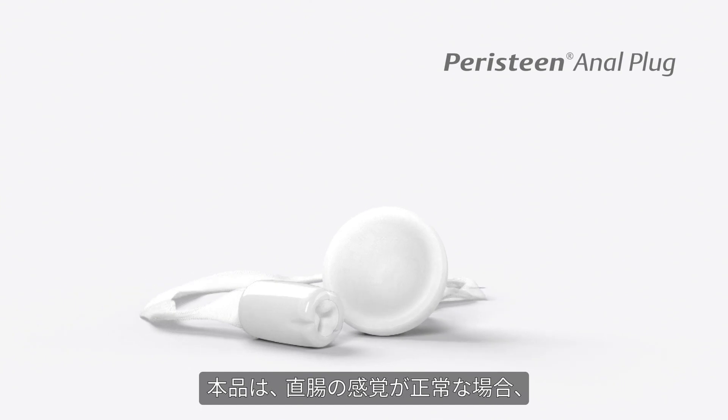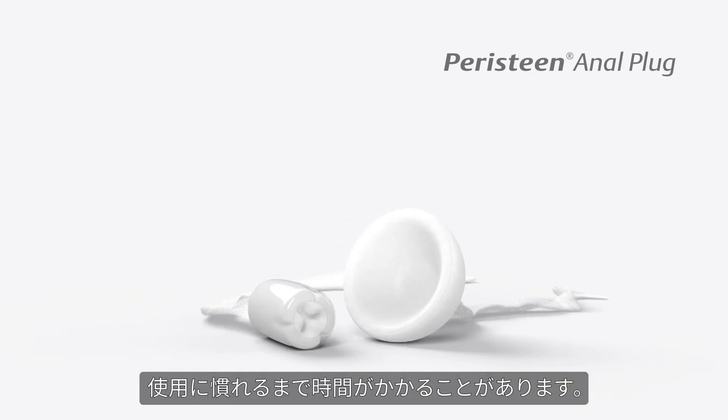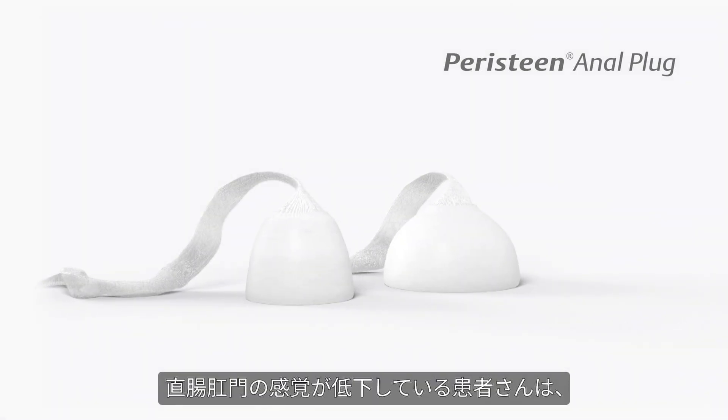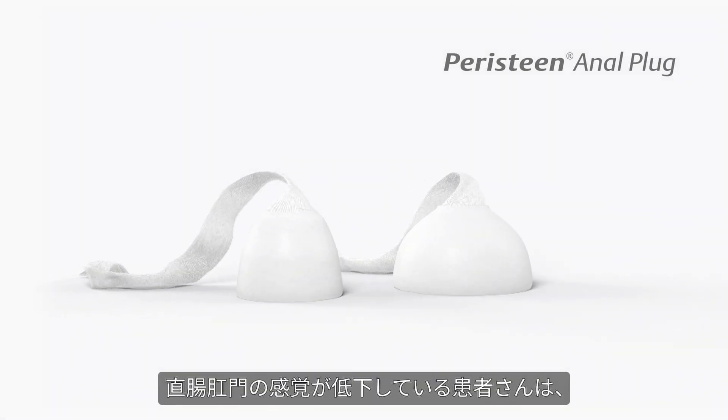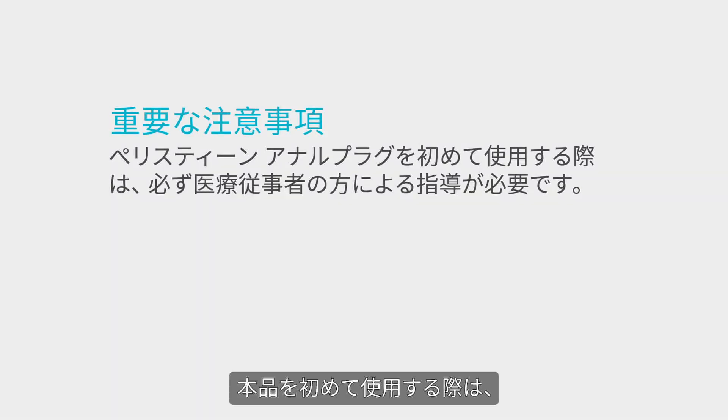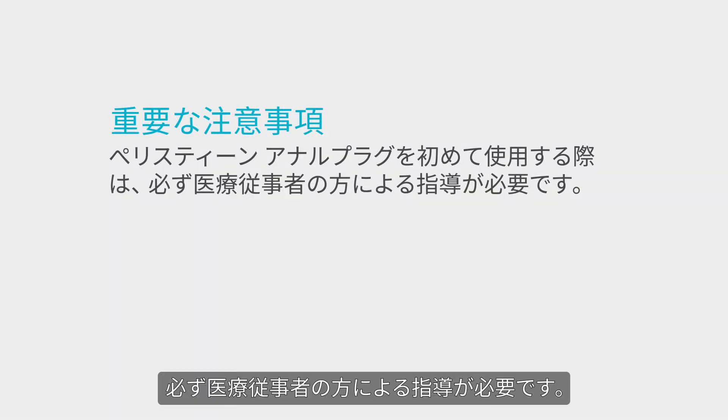The anal plug takes a little time to get used to for patients who have normal sensation in the rectal area. Often this is not the case for patients who have reduced or impaired sensation. Your professional guidance in the first time use of the Peristeen anal plug is vital.